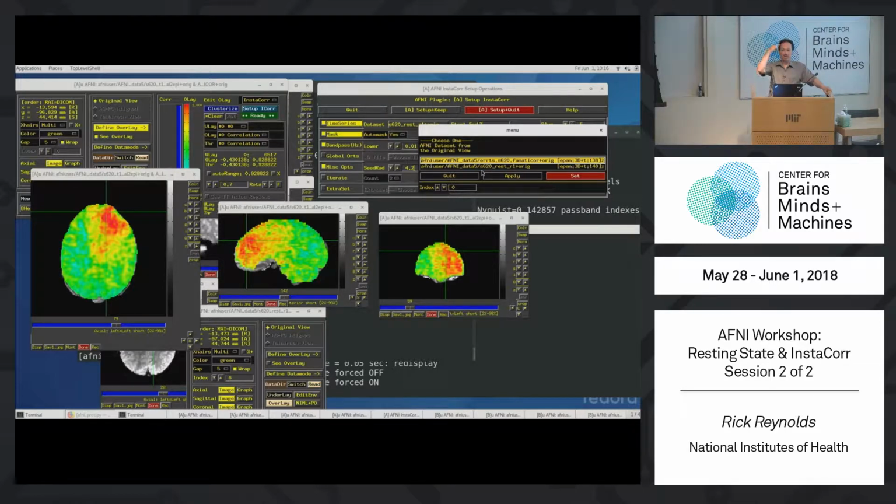So that means at each voxel, you take a local white matter average and regress that out, differentially for each location in space. You're doing a voxel-wise regression there. 1 degree of freedom for this step, but it varies across space. But otherwise, it's the same data pre-processed in approximately the same way that you might do in the GUI.